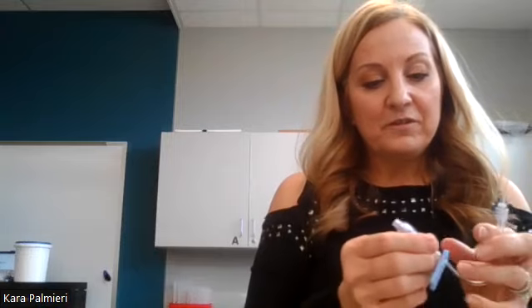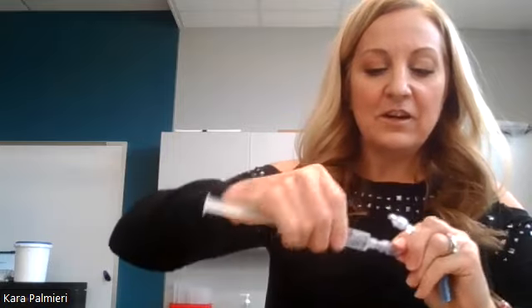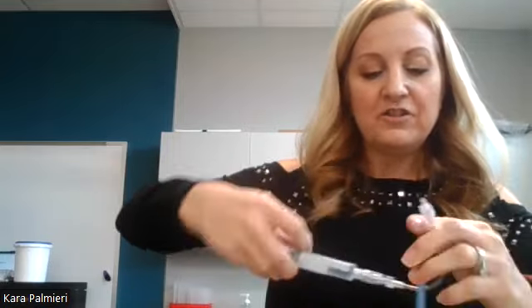I probably should have kept that on and done the flush first, but I'm keeping my tip without touching anything to keep it sterile. But I have to flush this J loop so that I don't give my patient any air accidentally. And this was just opened sterilely, so I don't have to clean this hub this time because I just opened it. But I'm going to just push a little bit of that fluid in until I see a bead at the top. Yep, there it is. So this is ready to go.